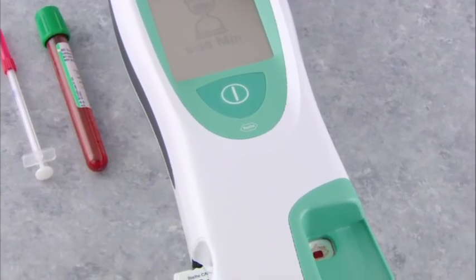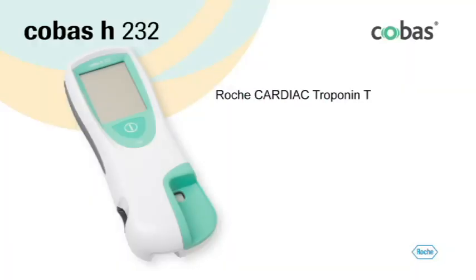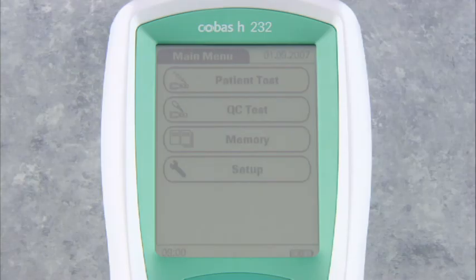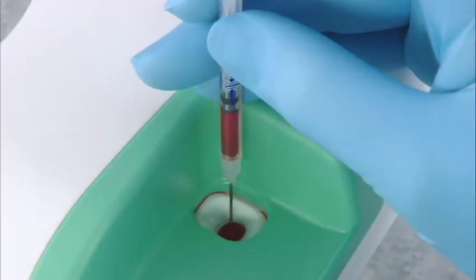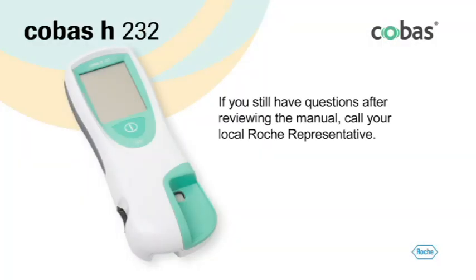You have seen how easy it is to perform a Roche Cardiac test using the Cobas H232 meter. The Cobas H232 system can also be used to perform NT-proBNP, D-dimer, myoglobin, and CKMB tests following the same steps outlined in this program. Note that some tests may not be available in all countries. The Roche Cobas H232 meter provides a fast and reliable way to measure cardiac markers in venous whole blood — you simply insert the test strip, apply the blood sample, and read the result. If you have any questions about the operation of the Roche Cobas H232 meter, please contact your local Roche representative.